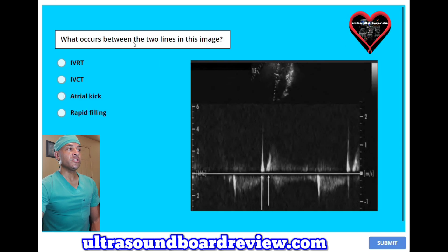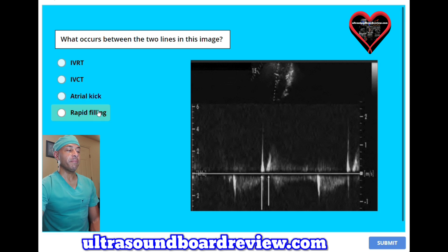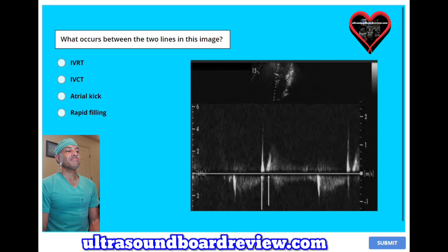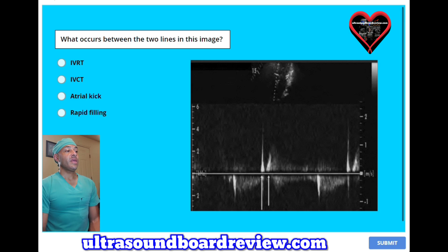What occurs between the two lines in this image? A, IVRT. B, IVCT. C, atrial kick. Or D, rapid filling. These are the two lines I'm talking about. The answer is A, IVRT.